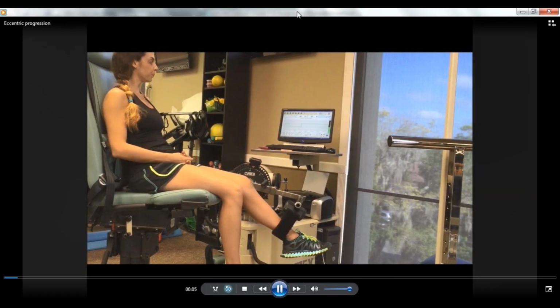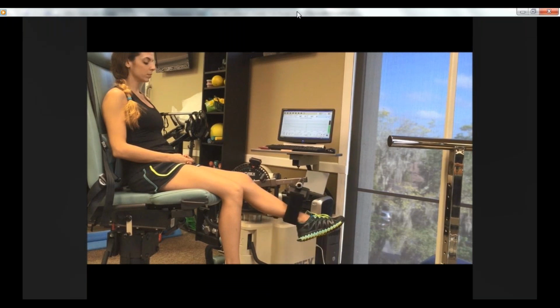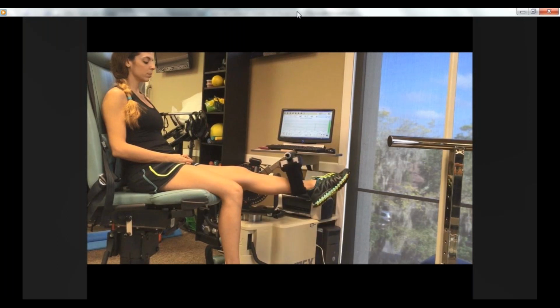So initially, what John alluded to was our eccentric unloading. The machine is performing the concentric for her. Once she gets to the top of the motion, she's going to lift off of the pad, that bottom strap. But now she's not pushing into the adapter arm. She's just following that speed down. She's essentially unloading those internal forces of her knee, the weight of the tibia, without any external load. And this is where we're going to start our patients off initially with eccentric loading.